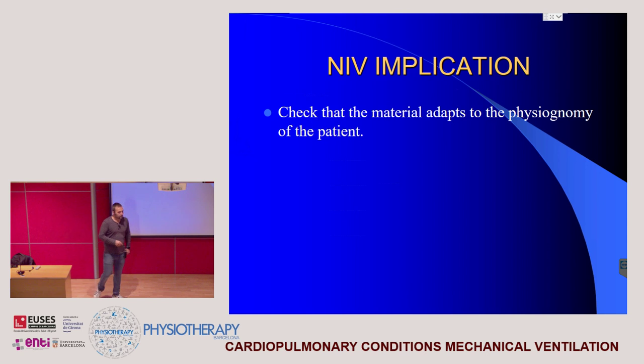And finally, in a practical way, during the non-invasive ventilation, let's say that the physician sets the parameters, and then we have to start the ventilation. This is something that could be performed also by nurses, by medicine, and of course by the respiratory physiotherapists.